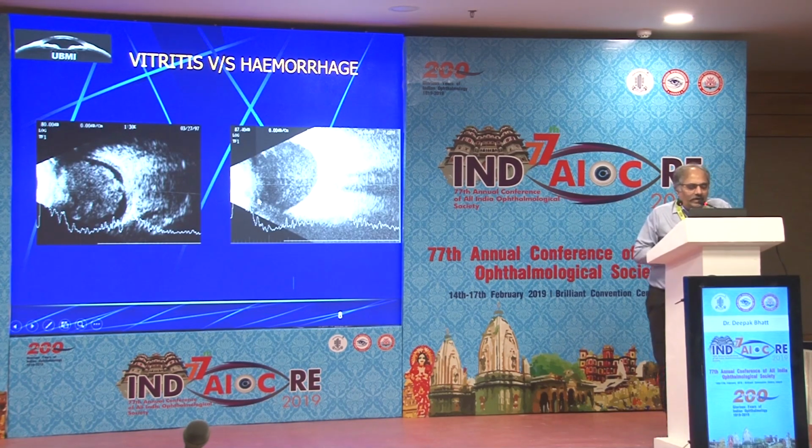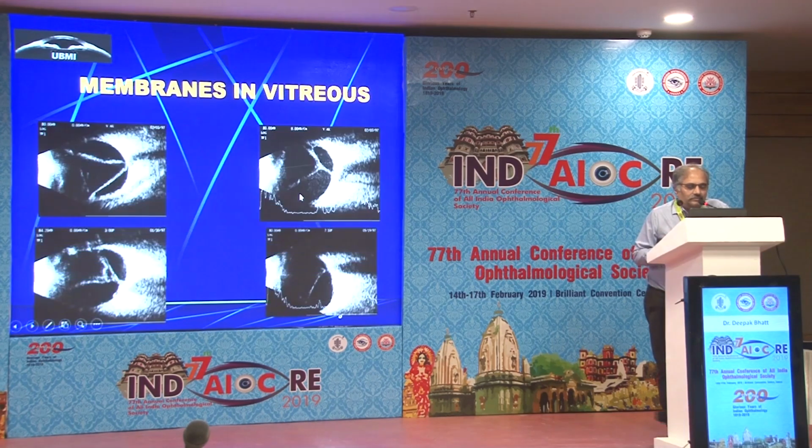Again, before we go ahead, I want to show you that this is vitreous hemorrhage and this is vitreous inflammation. See, they both look similar. It is more of a clinical diagnosis.